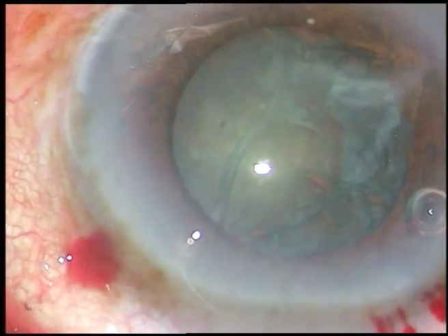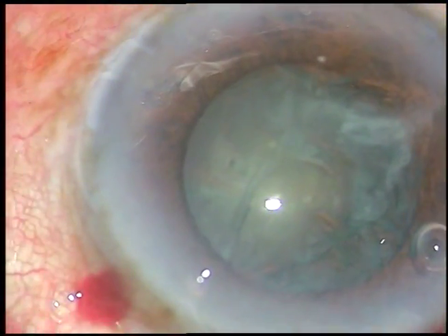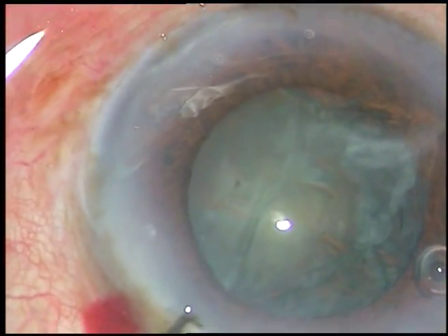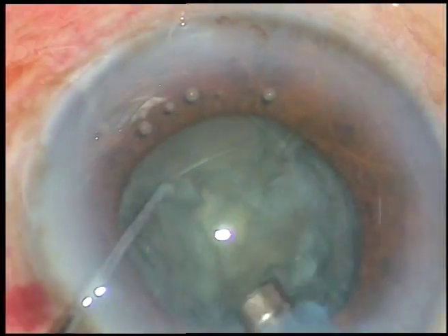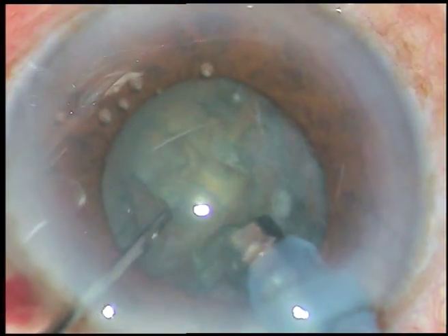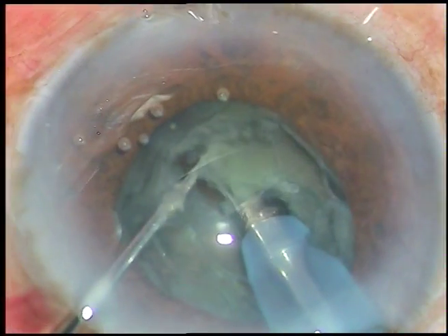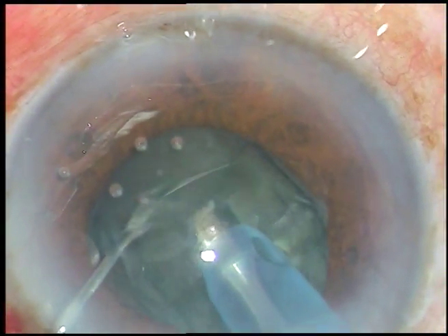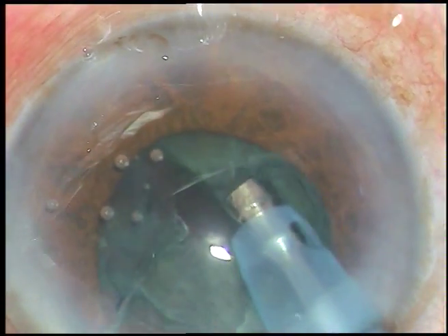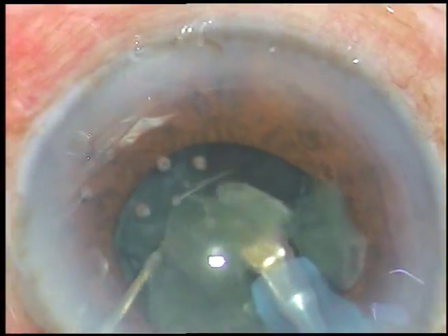Now the tip of the phaco handpiece is introduced. This is the Oertli Cataris 3 phaco machine. The tip is called EZ-Tip and it is introduced into the anterior chamber. The exposed part of the tip is buried into the substance of the nucleus — this is vertical chop. I engage the chopper just in front of the phaco tip and chop it. This anteroposterior division of the nucleus is vertical chop.